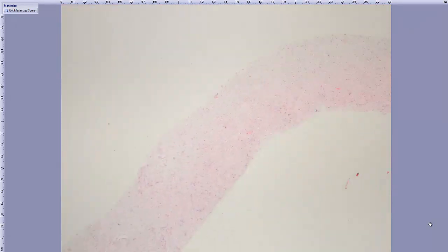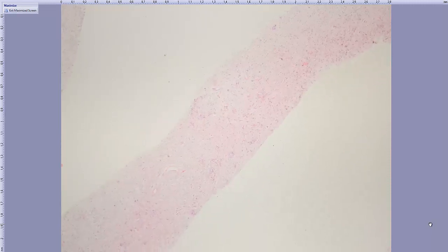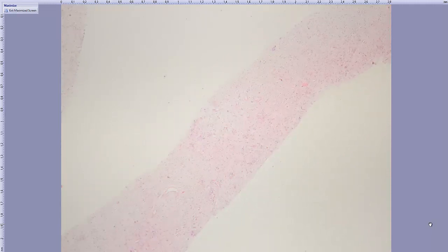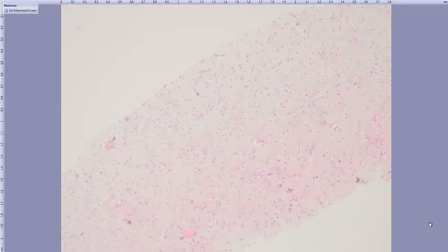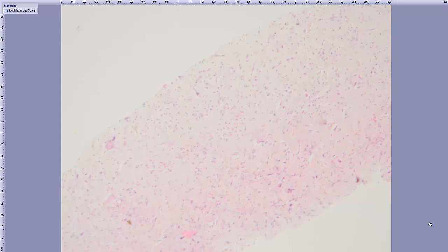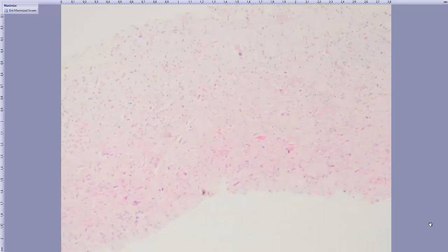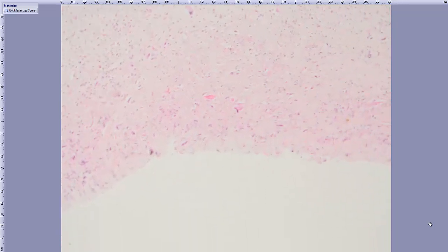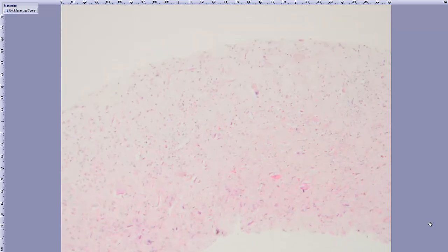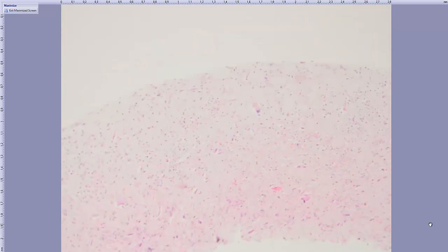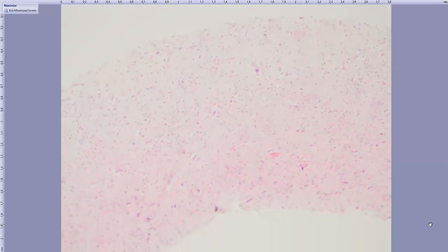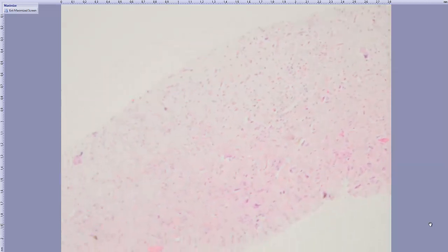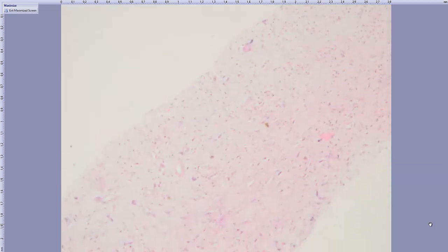At low power it has a hypocellular kind of look with a mix of collagenous background. Anyone can notice these funny-looking cells even at this power. They look pleomorphic.